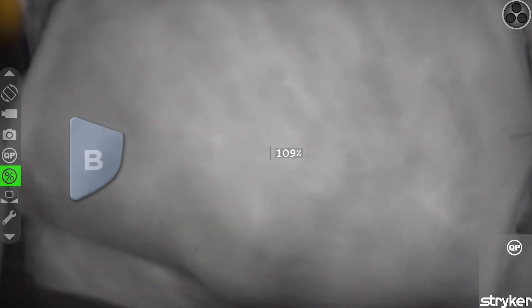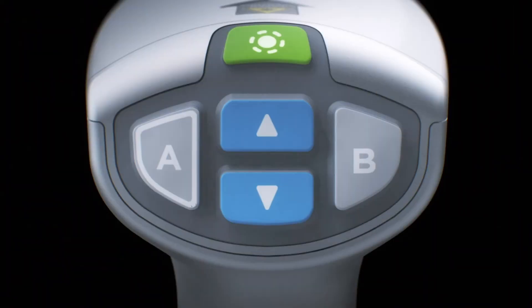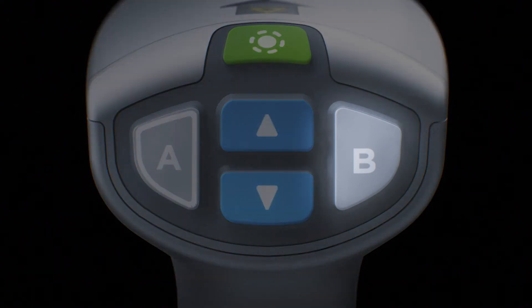If the user would like to reset the reference at any time, they can do so by pressing B to bring up the on-screen menu, navigating down to the percent icon, and pressing B again to select. This will remove the percentage values next to the quantification box. The user can now reset the reference by holding the B button.